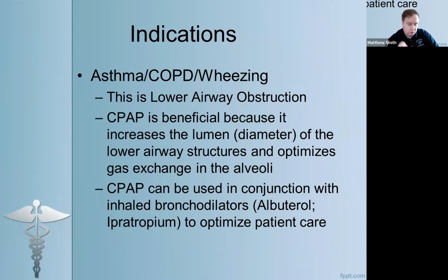Now, I want to call to your attention that if you are doing that inline nebulization, what you're not going to notice is that stream of mist coming up off of the nebulizer. The reason you're not going to see that is because the flow of air is so fast that it just gets whipped right into the lungs. So you're not actually going to see that stream of mist coming off the nebulizer like we usually see, but that doesn't mean that it isn't working, and you'll be able to see the fluid, the medication in the nebulizer chamber disappear over time. So that's asthma, COPD, and wheezing.